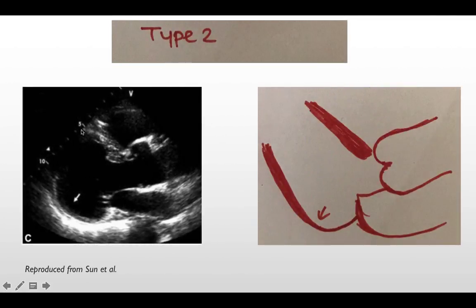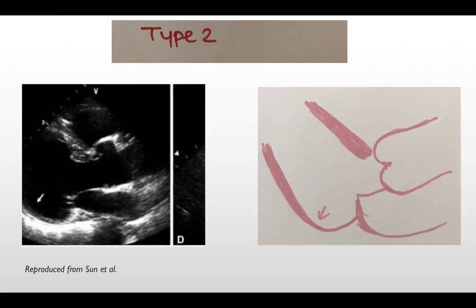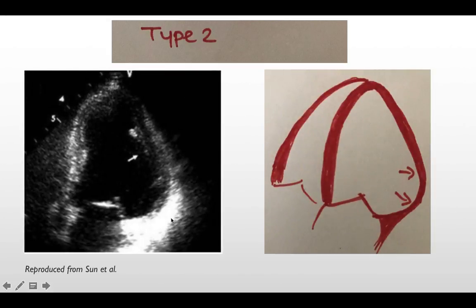The other type of sarcoid involvement, as we mentioned, is aneurysmal dilatation of the inferoposterior or lateral wall of the left ventricle. You can see it clearly here in the left parasternal long axis view, and also in the apical four-chamber view, showing aneurysmal dilatation of the posterolateral or inferior wall of the left ventricle.